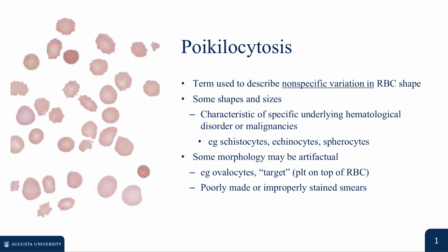Furthermore, we should remember that altered membrane lipid dynamics dictate specific true shape alterations. Equal expansion of cholesterol and phospholipids expands total membrane area to form target cells, an increased outer to inner leaflet ratio forms echinocytes, and an expanded inner leaflet relative to the outer leaflet forms stomatocytes.